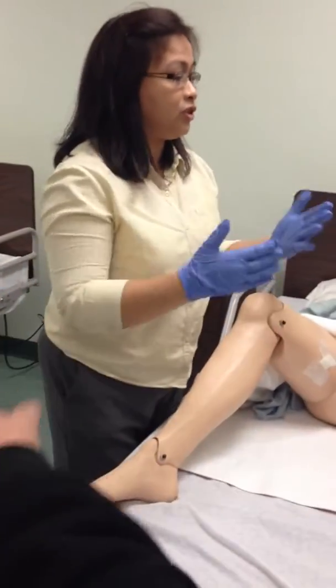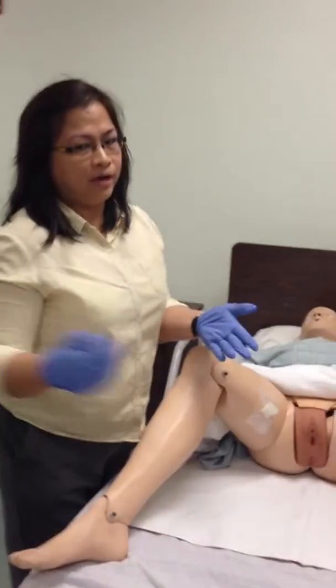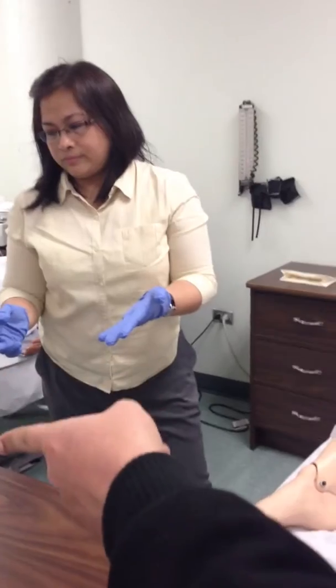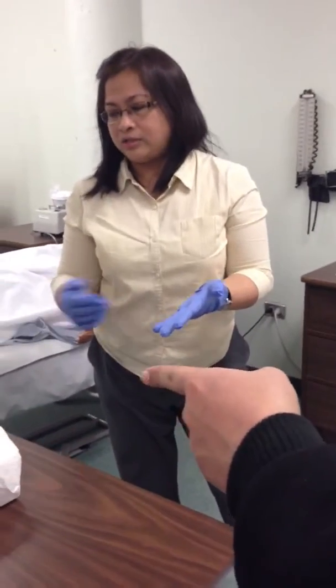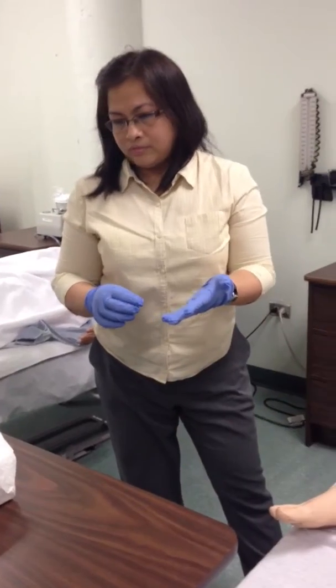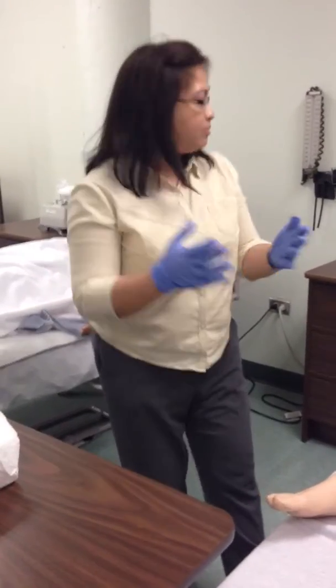So the teacher knows that you have to gather that one. It's a part of the test. We need the supplies: the container, the securing device, the scotch tape, no, the medical tape, and then you need gloves, clean gloves and sterile gloves.